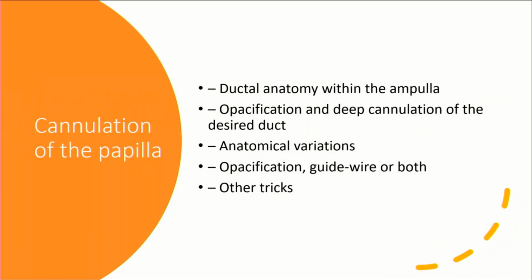Essentially, this is the outline of the talk. We're going to speak about the ductal anatomy within the ampulla, opacification and deeper cannulation of the desired duct, anatomical variations, opacification, guide wire, or both, and other tricks.